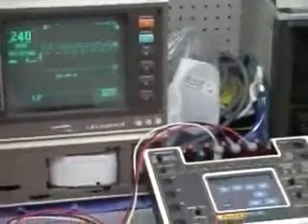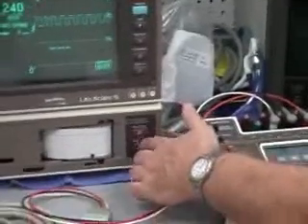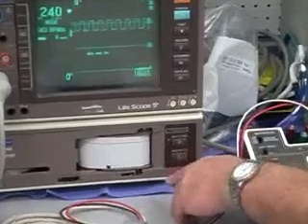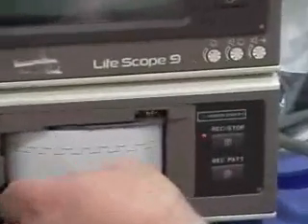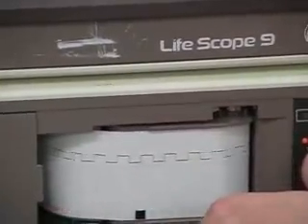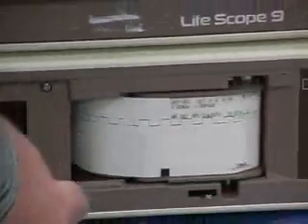And also if you want to check your recorder, it gives you the ability for checking that too. I think we're just eating our paper here. Okay, so we can do that. And then we also have a triangle wave.